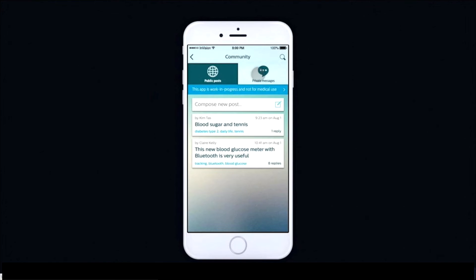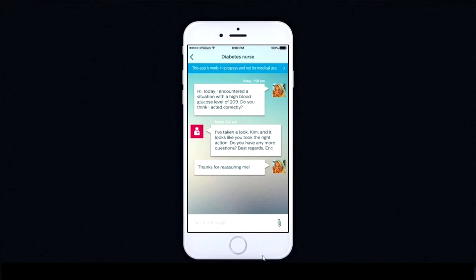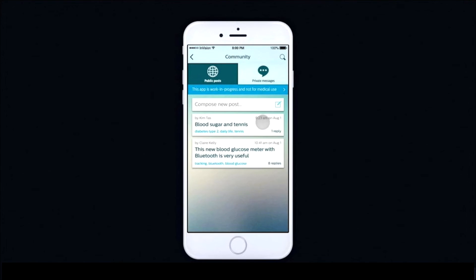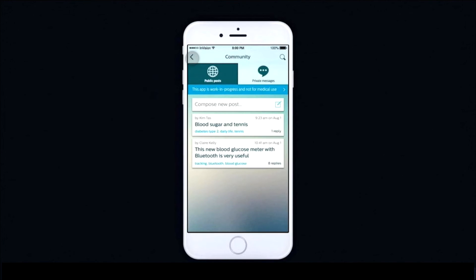An individual is able to share these readings within their community. For example, they can send a private message to a healthcare provider with information about a recent event or reading and get some feedback and guidance. They are also able to send a post in the public forum, which will go to anyone within their circle — that can be a healthcare provider, a fellow person with diabetes — and get information, guidance, coaching, support, and share ideas.